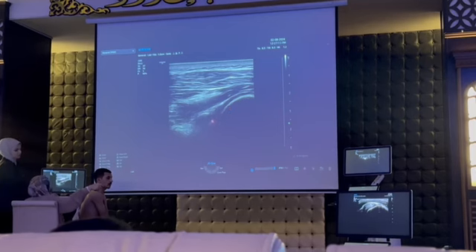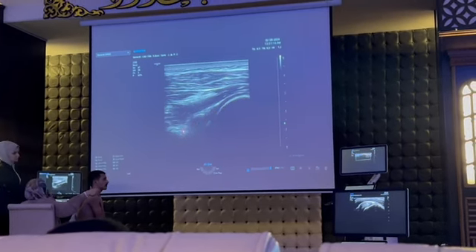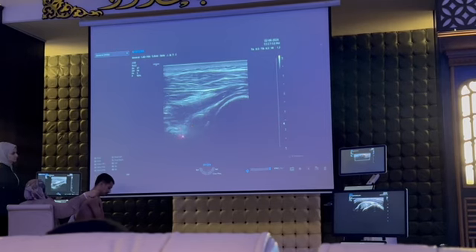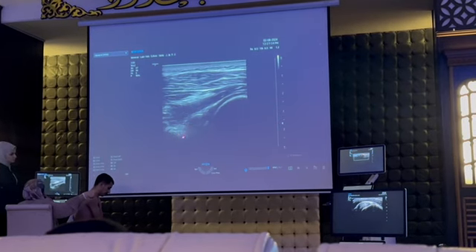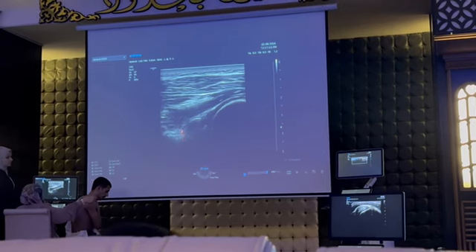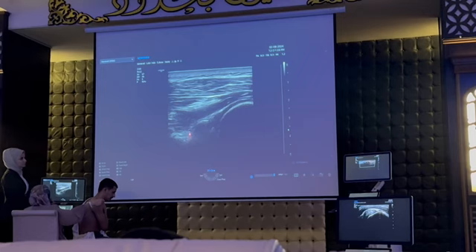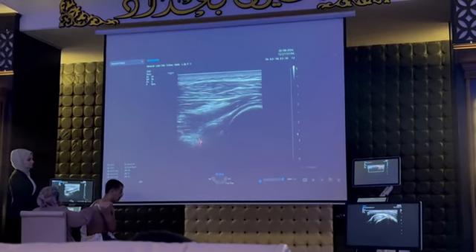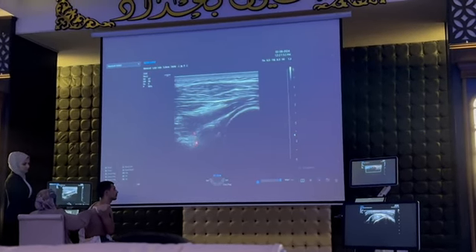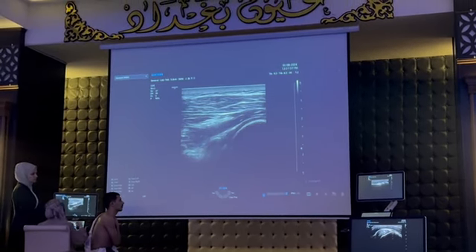In front of it is the fibrocartilage labrum. And in front of it, there will be a defect. I see with better resolution. This defect is called the spinoglenoid notch, containing the suprascapular nerve and vessel. But here the suprascapular nerve is only a sensory branch, not a motor branch. So I can do ablation here.